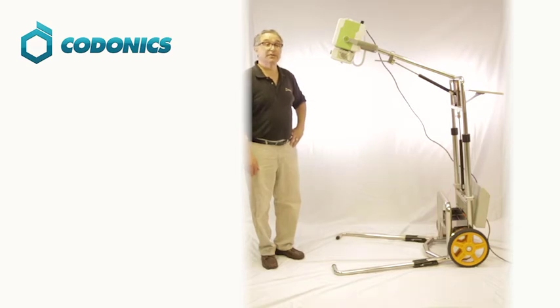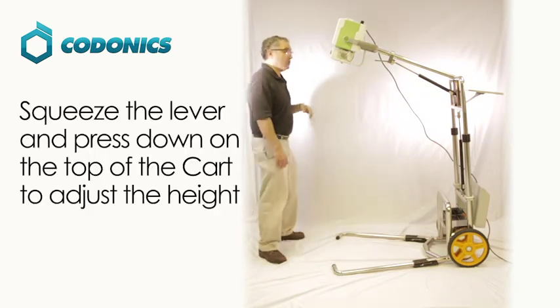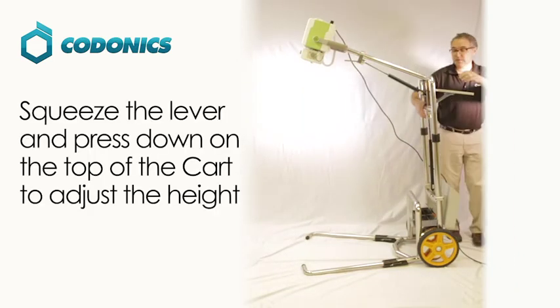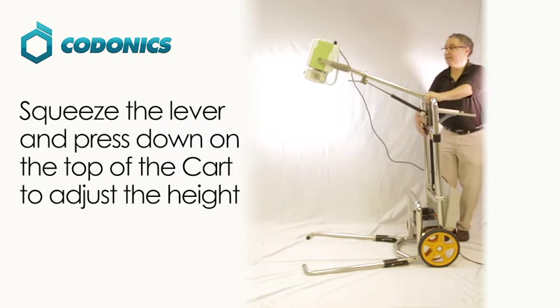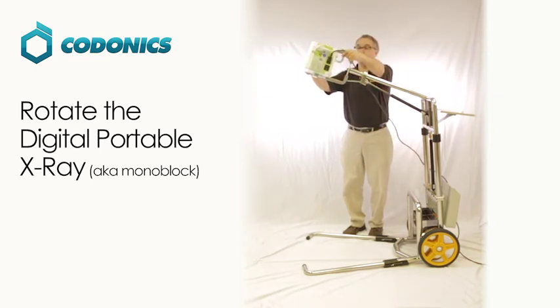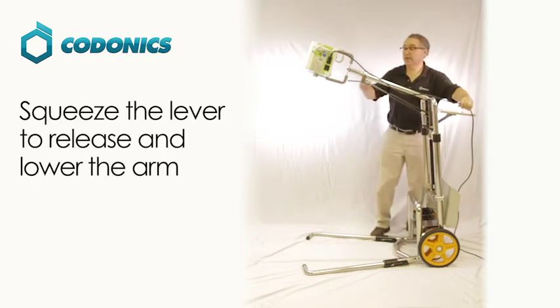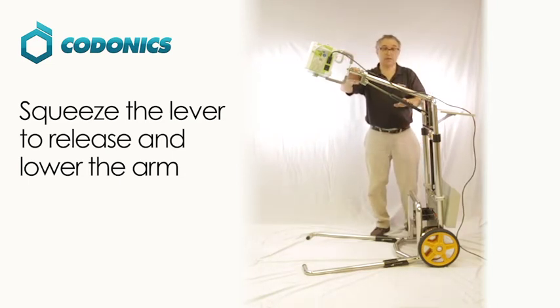Now we're going to talk about disassembling your Kodonix digital portable x-ray. The first thing you should do is remove your laptop and your DR plates from their holders and properly store them so they're safe. Next, lower the cart to its proper level by holding the lever down on the handle and pressing down. Then turn the head monoblock to get it in a good location and lower the arm holding the monoblock down to its lowest position. There are two pneumatic cylinders, so be careful when you pull the lever to properly push down on the arm.